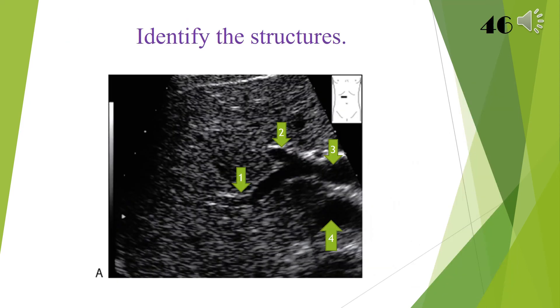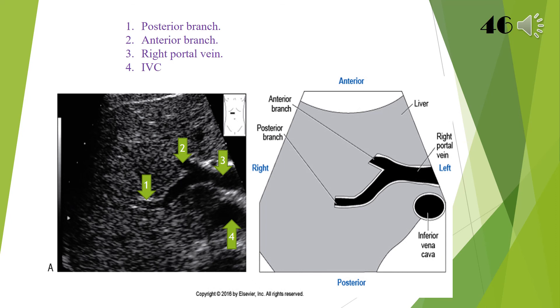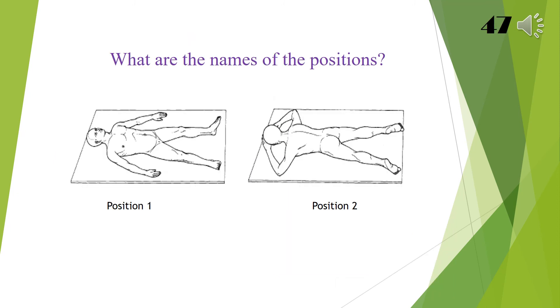Identify these structures: 1 posterior branch, 2 anterior branch, 3 right portal vein, 4 IVC.